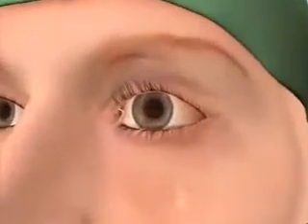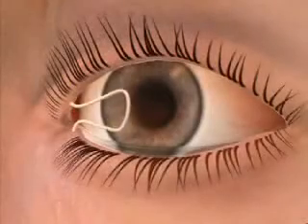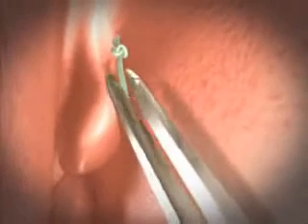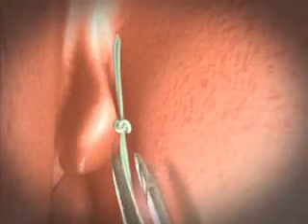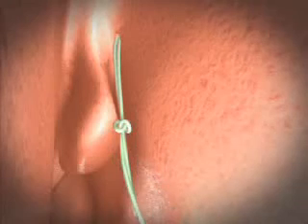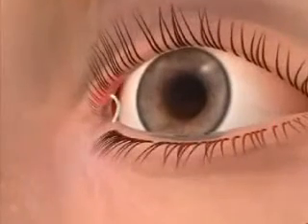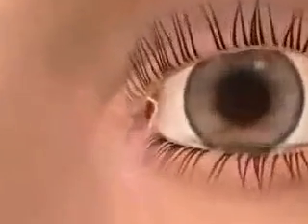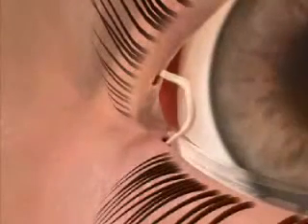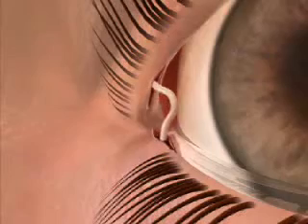Another complication we describe is lateral displacement of intubation. This can be easily resolved with the endoscope, and is relatively unimportant if the tubing is withdrawn early and periodical washing is performed. We suggest early withdrawal of intubation at 3 weeks to prevent granulomas and duct laceration, and to obtain the best possible outcome.